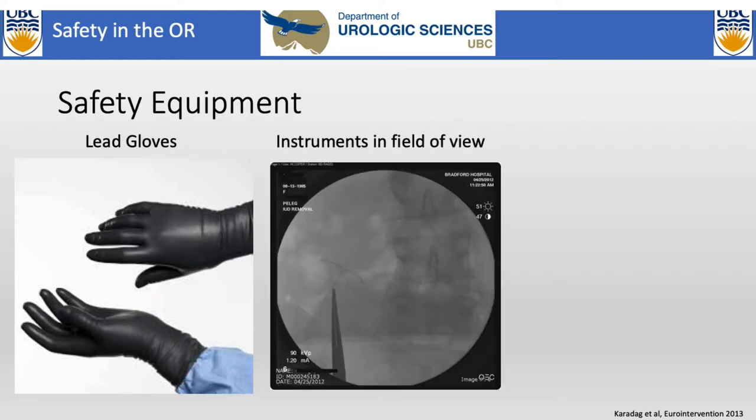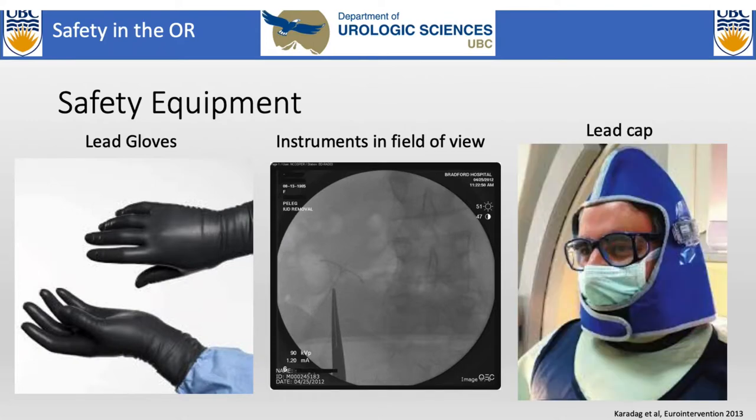Same thing goes with having instruments in the field. Dark items that go into your screen or into your image will increase the overall dose. The final thing is a lead cap, and I'm waiting to see Dr. Patterson walking around with one of these.